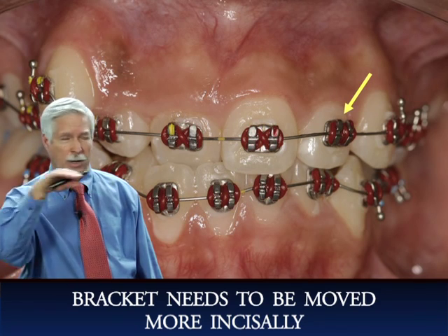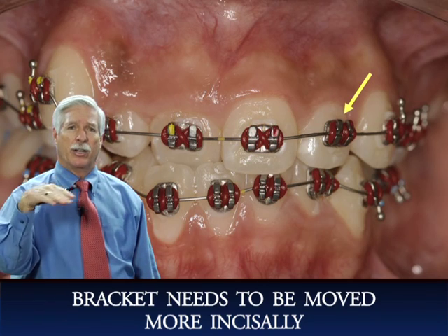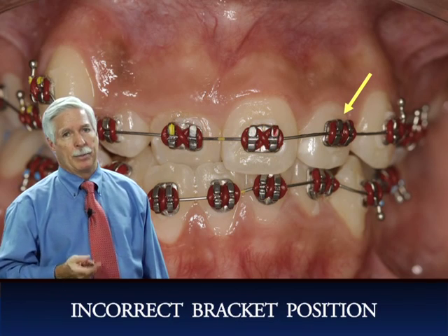We can put the brackets on and put the wires, and when we get to the rectangular wires, you're going to see they may not like that tooth, and they need to re-bracket that tooth. Okay, because that's incorrect bracket position.